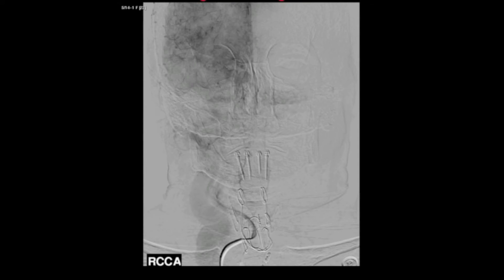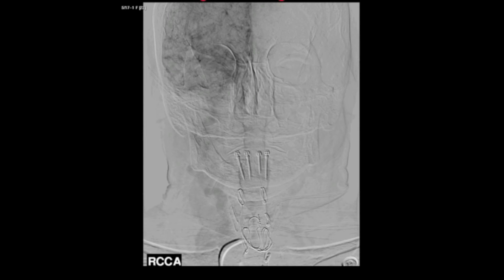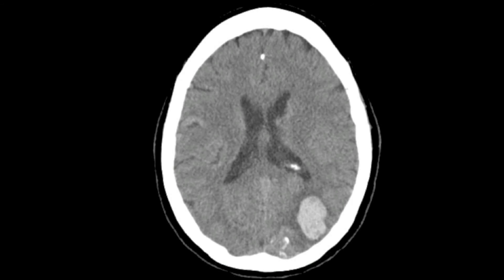The patient was offered treatment but declined and was lost to follow-up. Two years later, the patient presented with headache and right hemianopsia. CT scan showed left temporal occipital intraparenchymal hemorrhage.